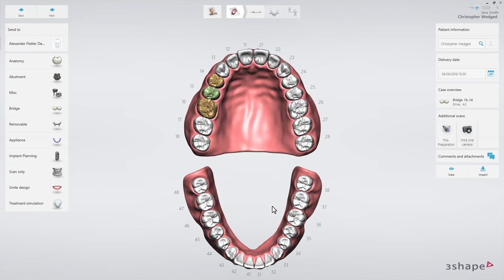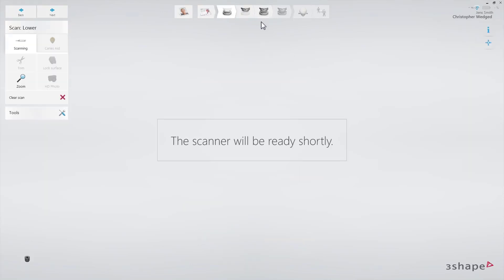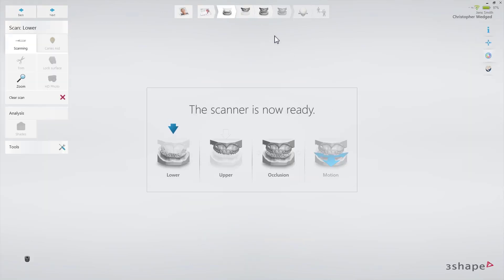Now you may proceed to the scan page. Use a retraction cord and/or hemostatic agent if parts of the margin are sub-gingival. In this case, start by scanning the opposing arch to allow time for the retraction methods to take effect.